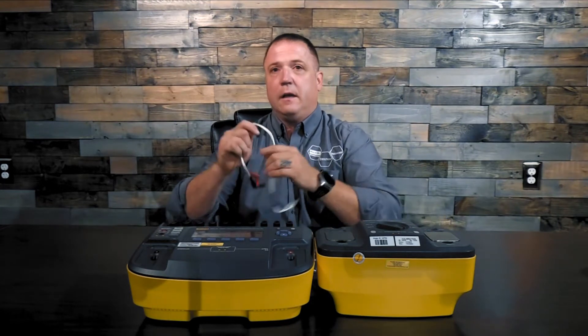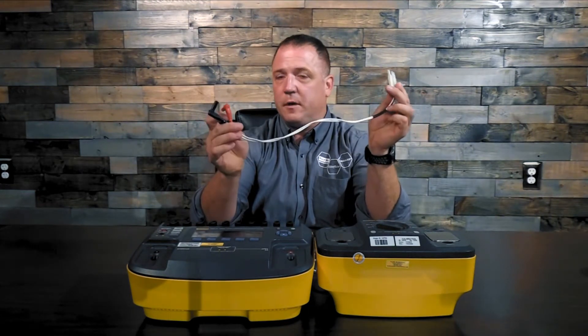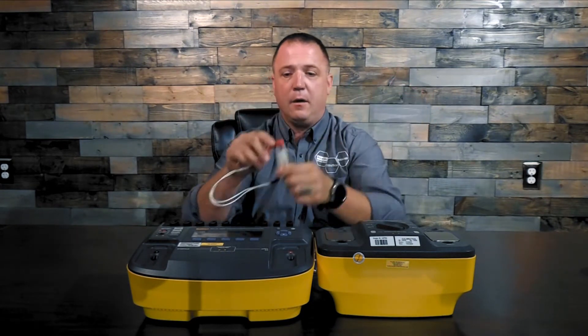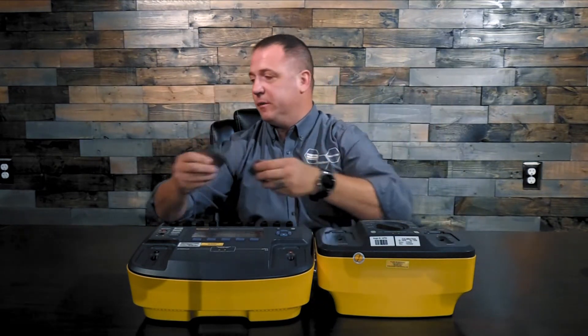The other thing you're going to need is a set of hands-free adapters. Most defibs anymore, we're no longer using paddles, so it's much safer to use the hands-free adapters, in which case the stainless steel plates that come on the 7010 loadbox can now be removed.